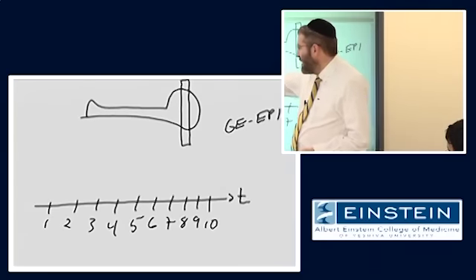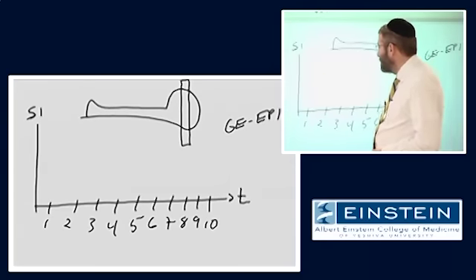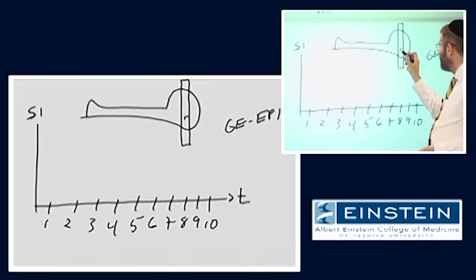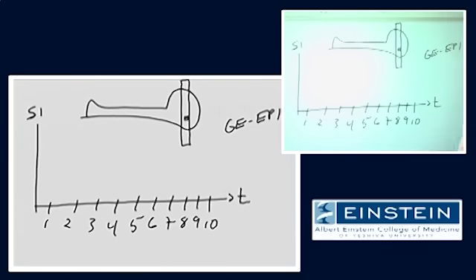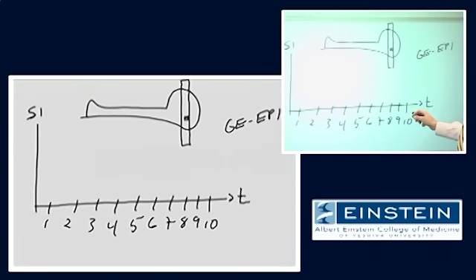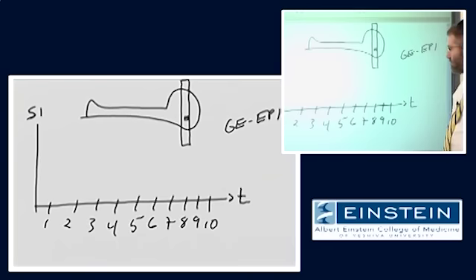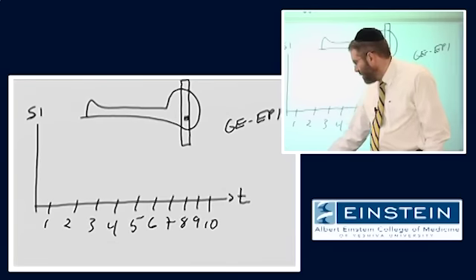So we could plot the signal amplitude, the signal intensity, from some particular location in that image and watch what happens to that signal intensity over time. 10 seconds is probably too short for this to be a realistic example.